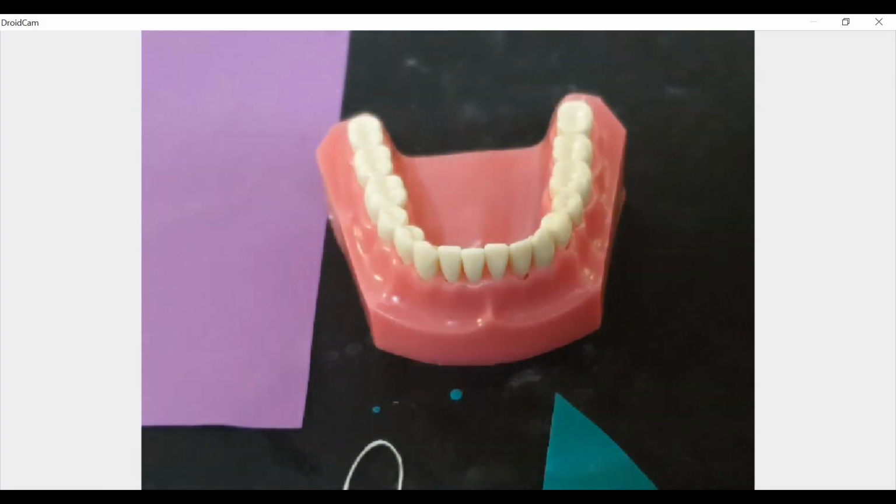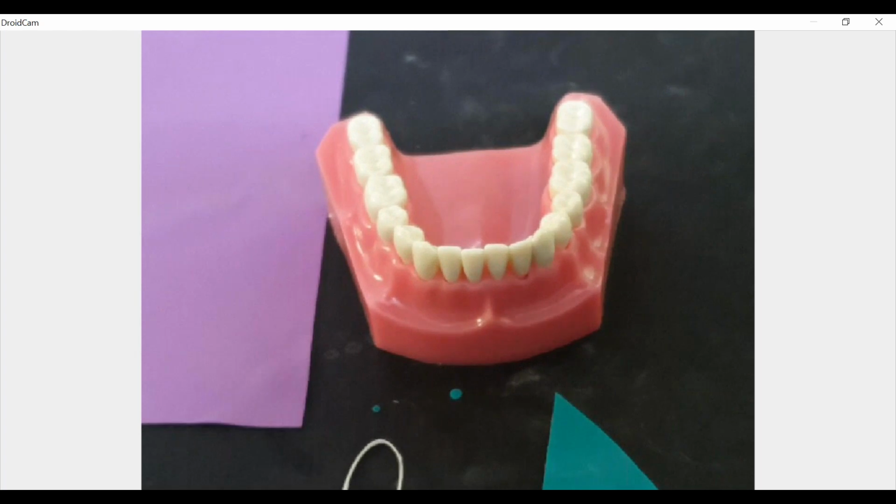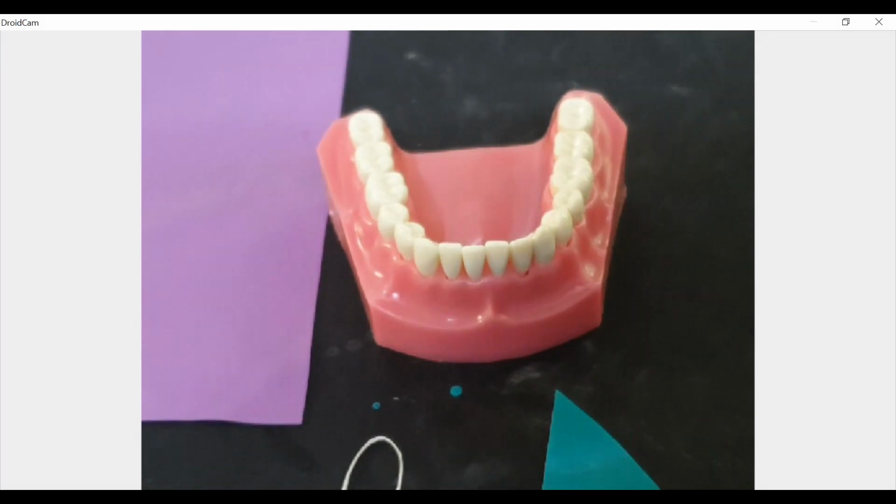Now, the armamentarium which I am using, the kit which I have chosen, I have not chosen the Brinker's one. I am going to use the ones which are there over here, because that will help you know which one can be used. So we already used the number 7. So let us try. Let's see what we have here. Yeah. So let me try the 12A.